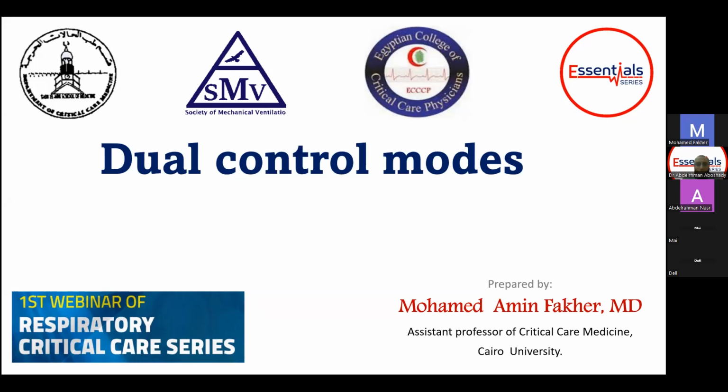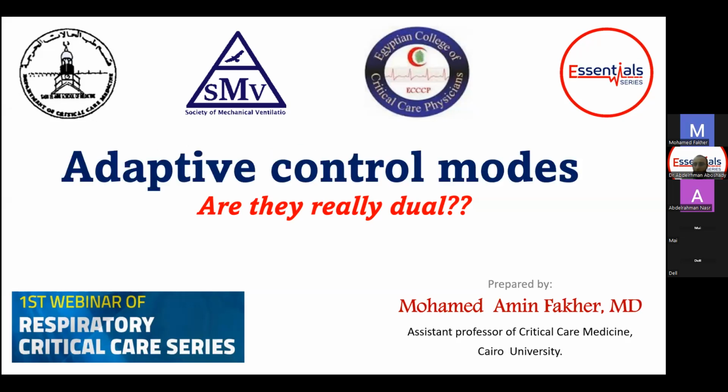Most of us know about volume control mode and pressure control mode. Yet, some of us have practiced what are so-called dual control modes. I would like to start my lecture with this strange yet very important question: are these dual control modes really dual? Do they follow the taxonomy or the classification of dual control modes? Surprisingly, the answer to this question is no. I don't prefer to call them dual control modes. So we would change the title of the lecture to adaptive control modes.